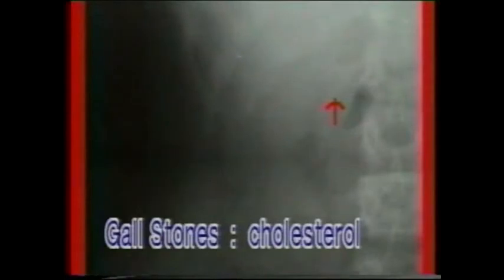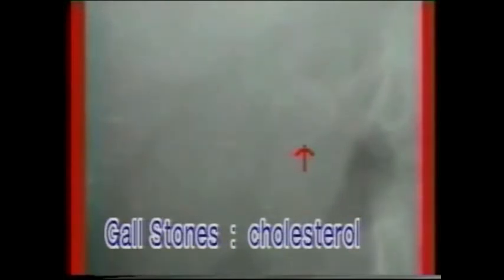This X-ray shows a very faint shadow of a single large gallstone — a cholesterol stone. It has a spherical shape and only the rims are calcified, giving it a ring-like appearance. It is not densely radiopaque like renal stones and casts a very faint shadow.